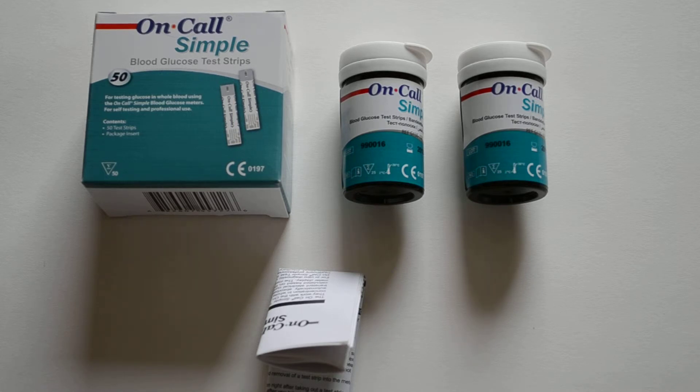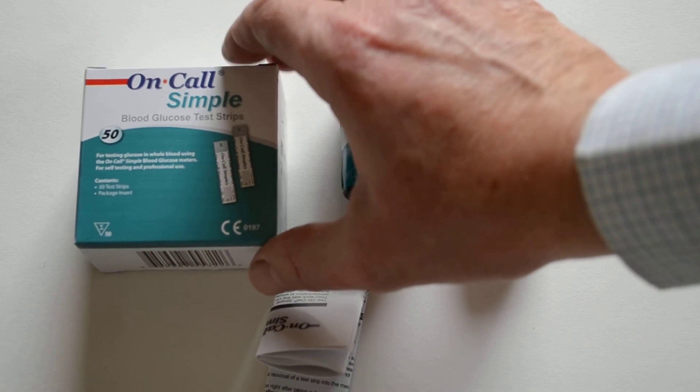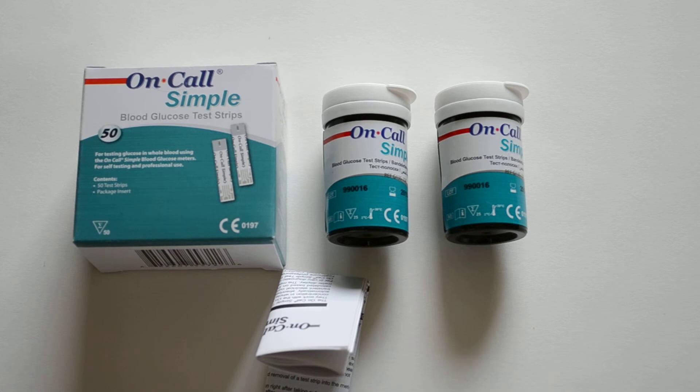There is no code chip required with these meters. When you order the pack, you receive this carton which contains two individual vials, shown here, each containing 25 blood glucose test strips.